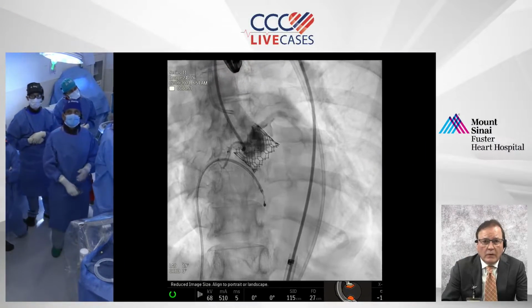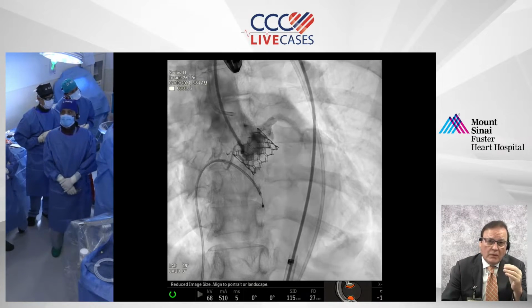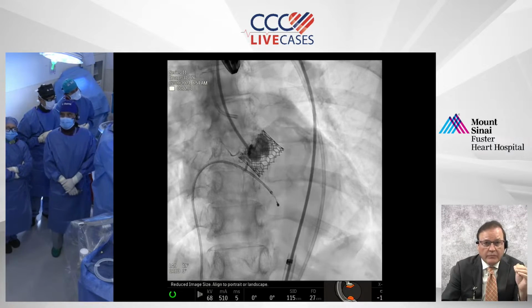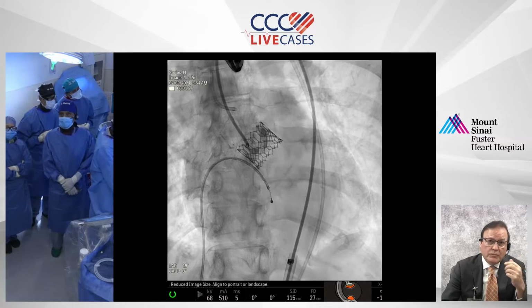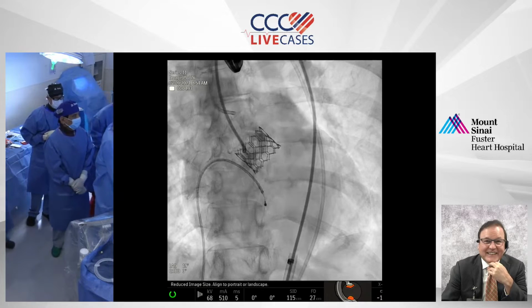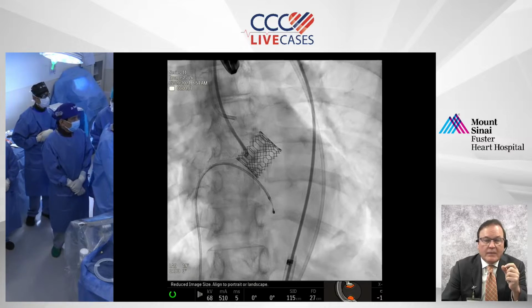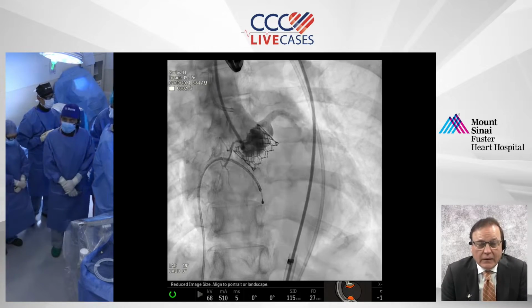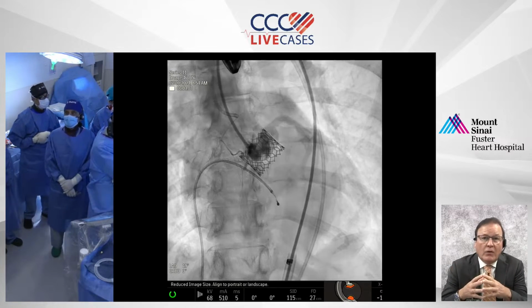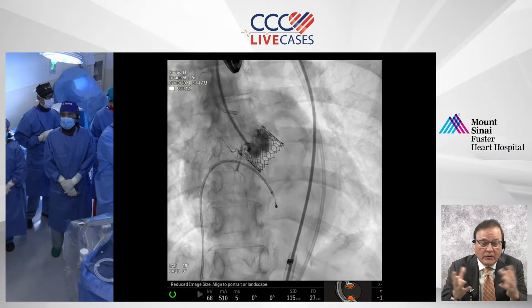Question: what is the likelihood of recovering the left main in the Redo-TAVR? Is it easier, more difficult, or more commonly done than in the native, de novo TAVR? Don't know. We'll see it today. Just say the Redo-TAVR will have a high chance of occlusion. Exactly, but he's talking about the recovery of the left main. Because the question here will be the chances that we will rupture the annulus with, let's say, a little bit of oversizing in balloon valvuloplasty is lower now, a year after, because it's underexpanded.